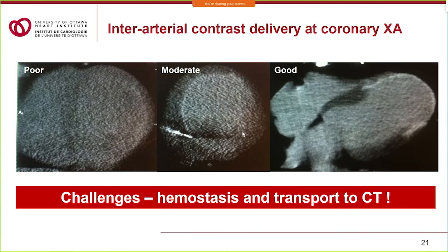So one of the questions is, could we do this better? Because I think CT scar imaging is still a bit of a niche enterprise. This is some work that I did with Vijay Chawan when I was still in Toronto, and we tried using intracoronary delivery of contrast in order to see scar, because I think the problem is you give an intravenous injection, everything's just too diluted. What you really want to do is deliver the contrast in a concentrated form to the myocardium via the coronaries. And here are 3 examples, one which I think you probably struggle to see very much.